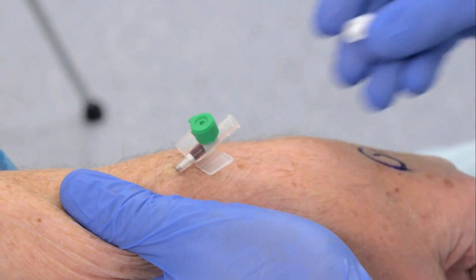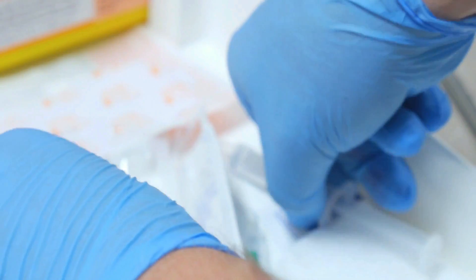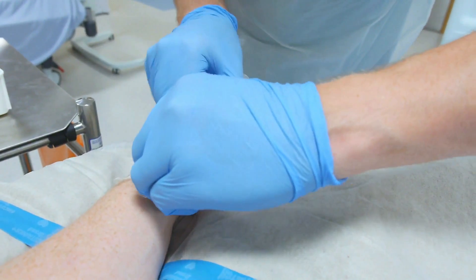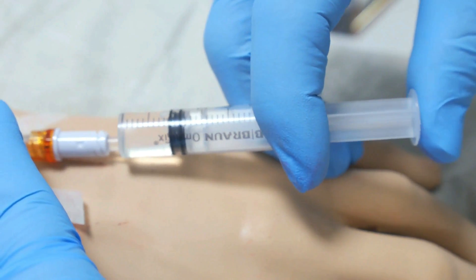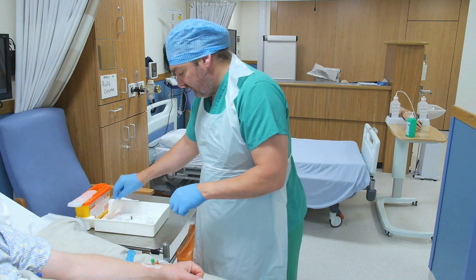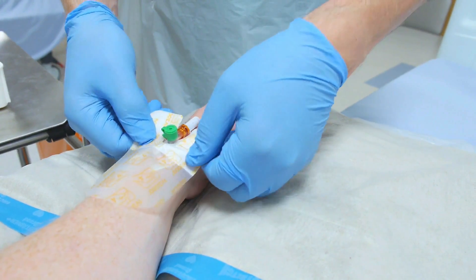Allow blood to fill the device and attach a cap or suitable interconnect system. Using the Steri-Strips supplied, secure the cannula wings to support the cannula. Draw up 5 mls of sodium chloride in order to flush the cannula, which will ensure patency. Flushing should be carried out according to local policy and must be prescribed on an as required basis on the patient's cardex. Apply the remainder of the dressing and ensure that the transparency covers the insertion site.